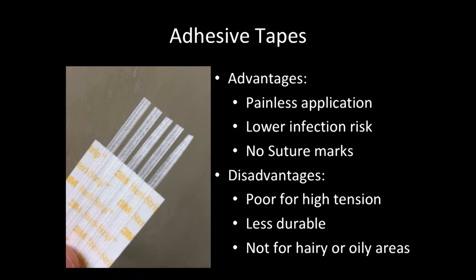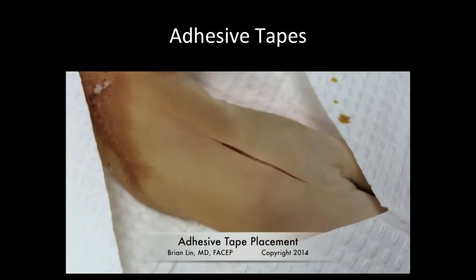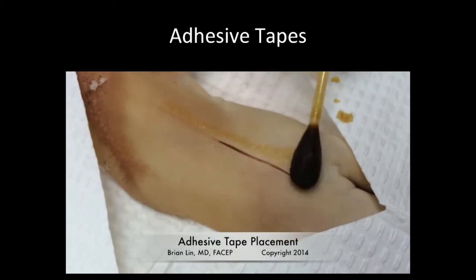One of these methods is the use of adhesive tapes. The advantages of using adhesive tapes are that they're painless to apply, they've got lower risks of infection, and they don't leave that risk of leaving unsightly suture marks. Now the disadvantages are they're not as good for high tension wounds, they are somewhat less durable, and they're really not easy to use on hairy or oily areas of the body. Here's an example of application of adhesive tapes.